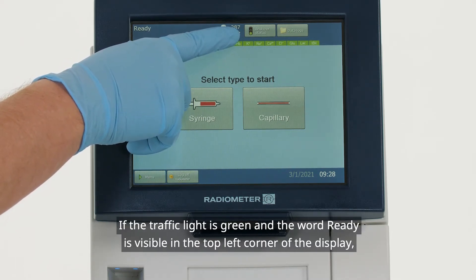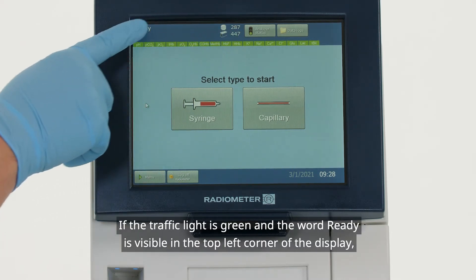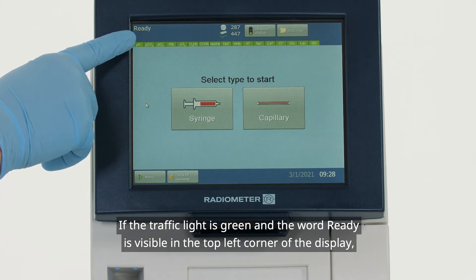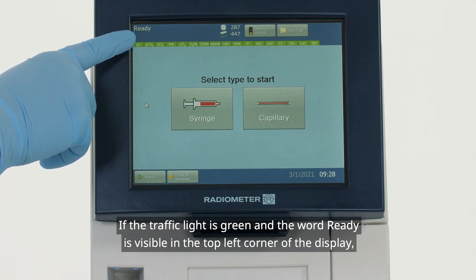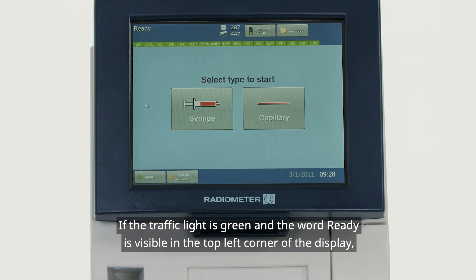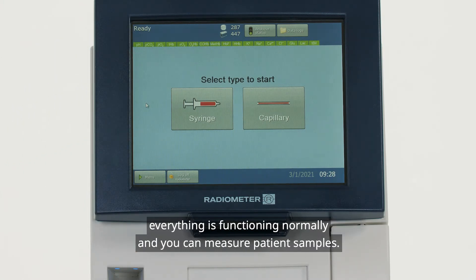If the traffic light is green and the word 'ready' is visible in the top left corner of the display, everything is functioning normally and you can measure patient samples.